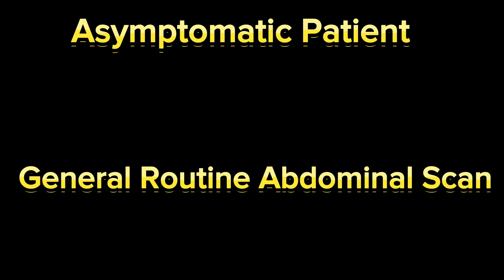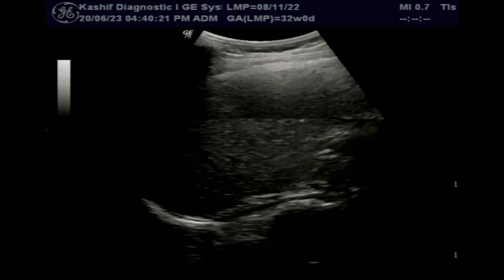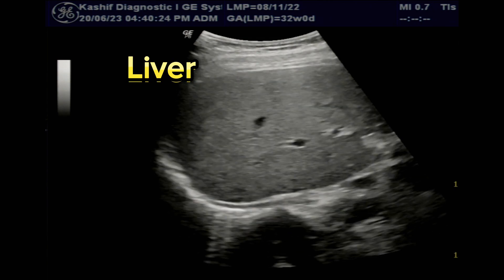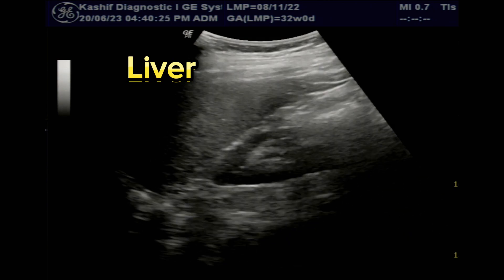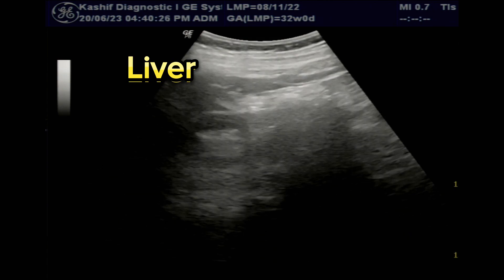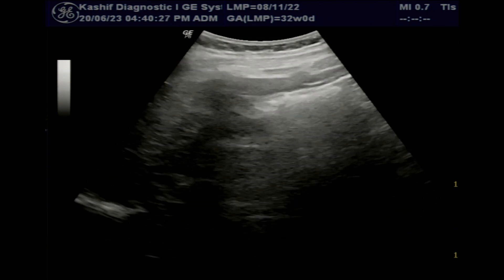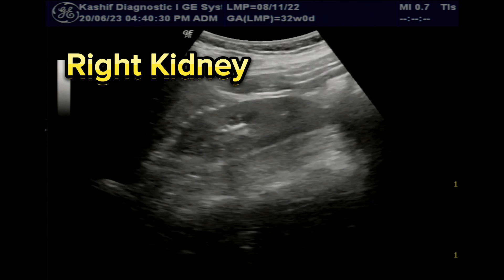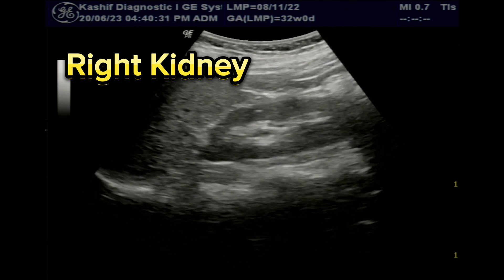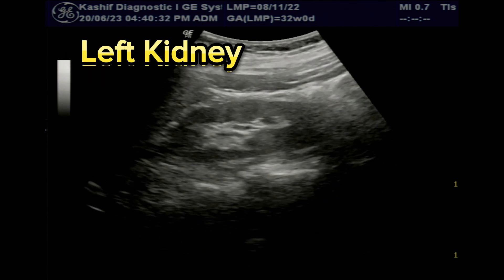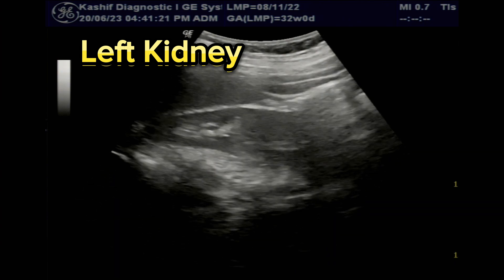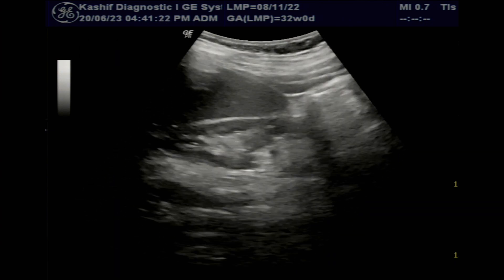This is an asymptomatic patient with a normal routine abdominal ultrasound scan. The liver is normal. Right and left kidneys are visualized. Both are normal in size and echogenicity. No calculus, no hydronephrosis seen.